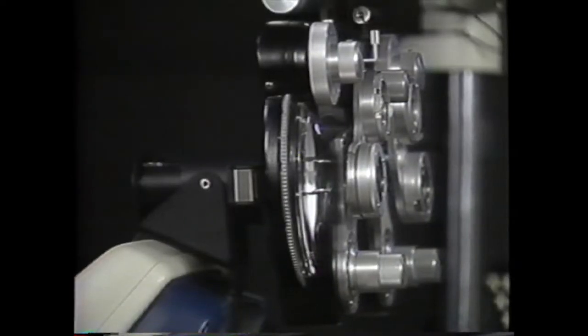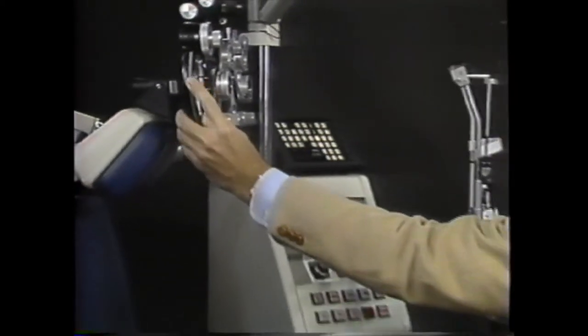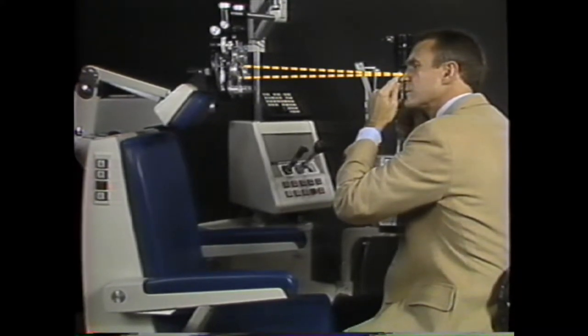The whole point of the neutralization technique of retinoscopy is to use lenses to bring the eye's far point to the peephole of the retinoscope held at the normal working distance.